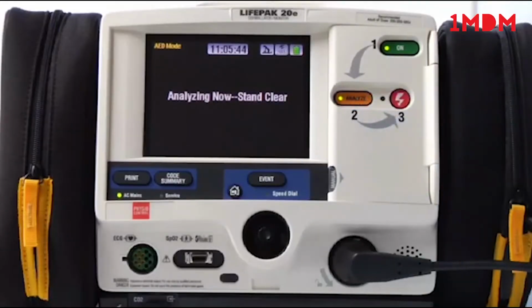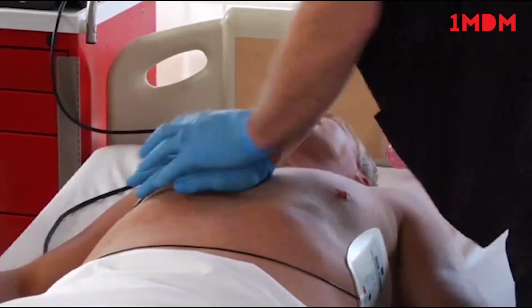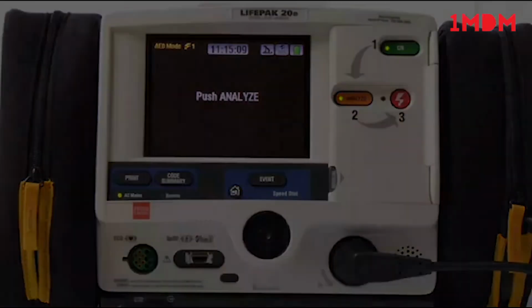Okay, let's go back to the beginning. You've determined the patient is in cardiac arrest. You followed the screen prompts and pushed Analyze. Analyzing now. Stand clear. But the AED does not find a shockable rhythm. You get this message: No shock advised. Then it goes straight into CPR time. Start CPR. At the end of CPR time, it tells you to push Analyze, and the cycle repeats as necessary.